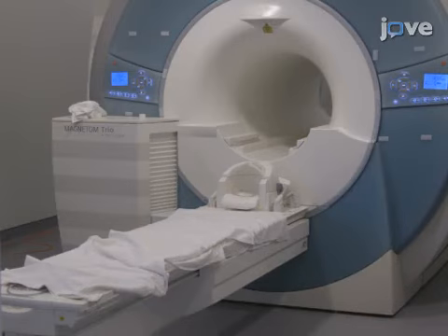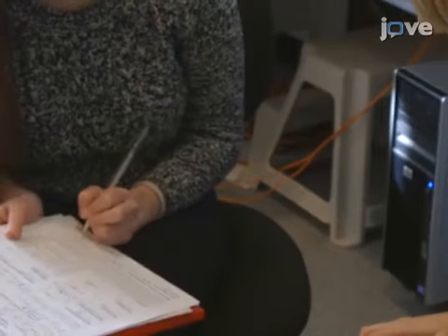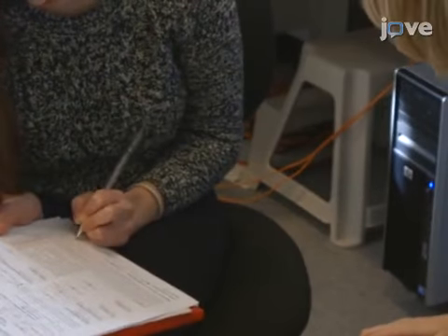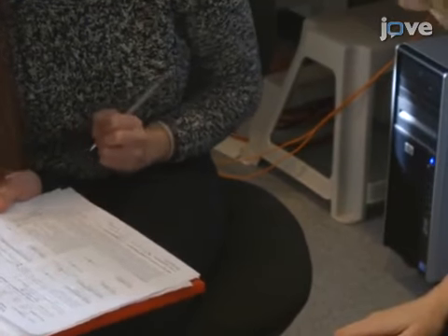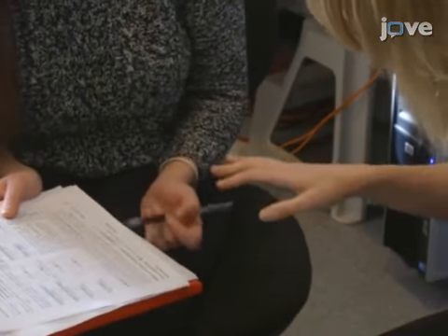Acquire all imaging as described in this protocol on a 3 Tesla MRI scanner equipped with a 32-channel head coil. Prior to imaging, first thoroughly screen every participant for MRI safety and have them sign a consent form describing the protocol.